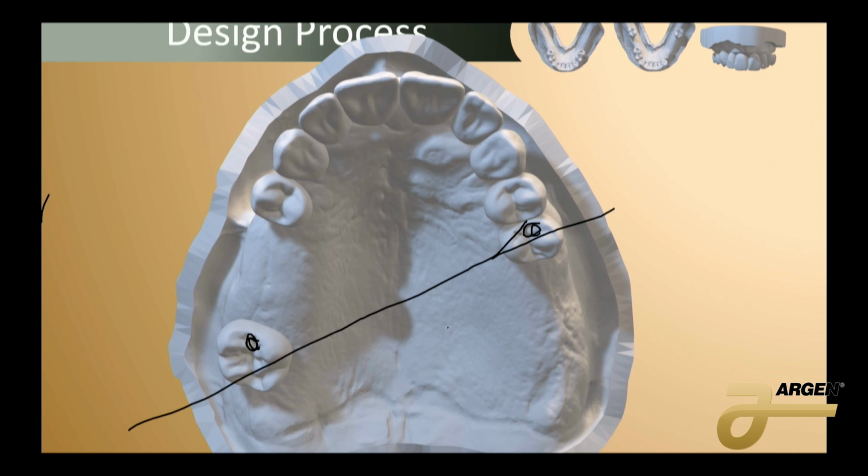So that's actually going to come this way. So now we know we need to reciprocate it on that side of the arch. It has to be perpendicular to the fulcrum. So now we know our reciprocation for this whole object should be on this side, meaning we can put a rest here. This rest here on this side, between these two teeth, these two can just be like this.